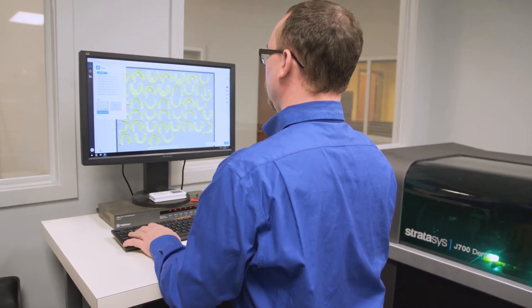The clear aligner market is expected to reach three billion dollars by the year 2020. We don't need all of that, but we'd like a percentage of that.